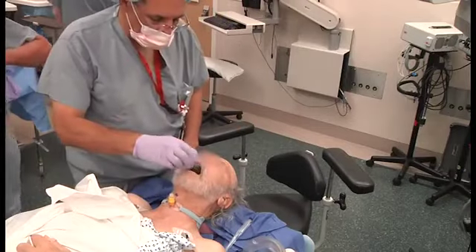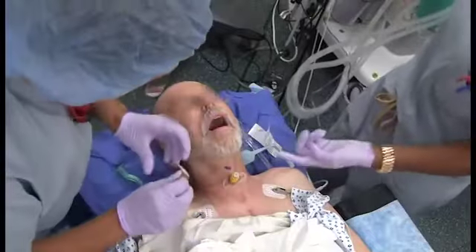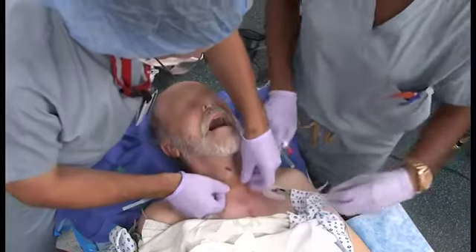The patient emerges from anesthesia, and the transcricothyroid membrane catheter is removed and a Band-Aid is placed.